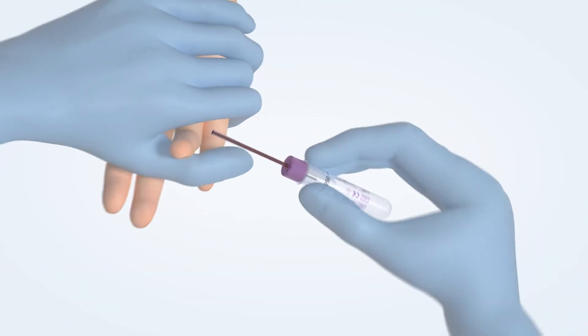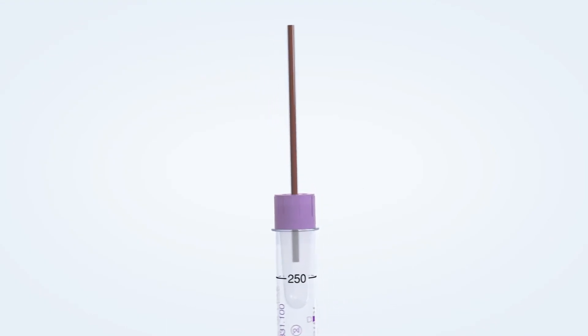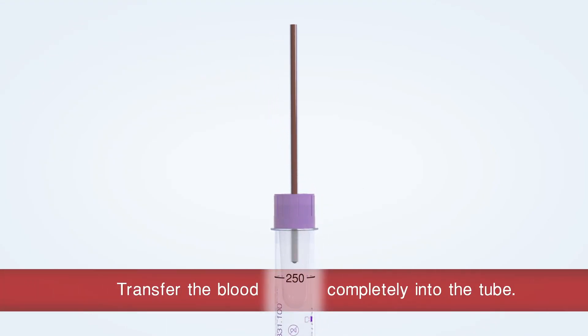Turn the Microvette APT250 upright and let the blood from the capillary flow completely into the tube.